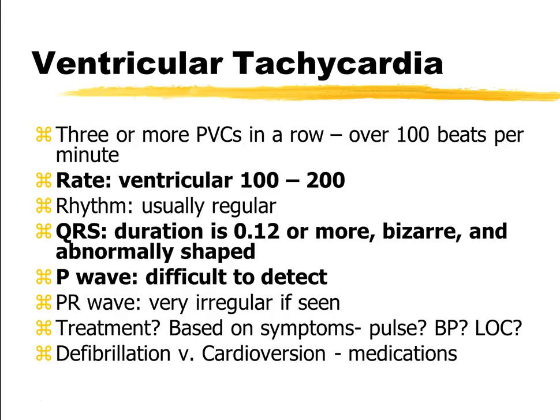Your AEDs, your automated external defibrillators, are going to sense this rhythm, and they're going to say it's okay to shock that. If they're awake and looking at you and say, oh, I feel terrible, I don't feel right, then we may choose to cardiovert them or use medications, either electrical cardioversion or medication cardioversion. So we'll try to snap them back.